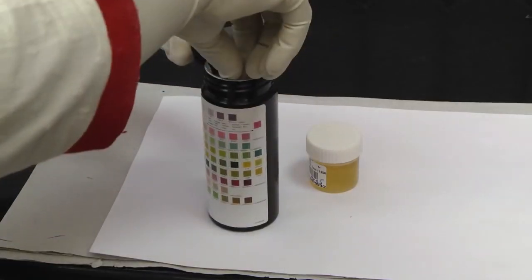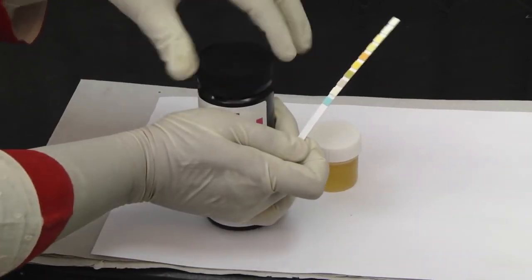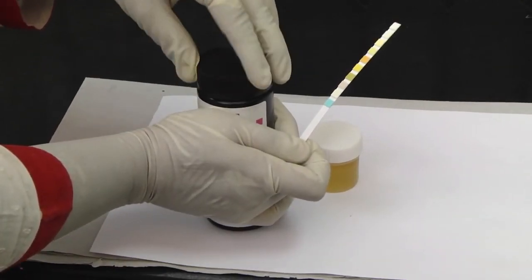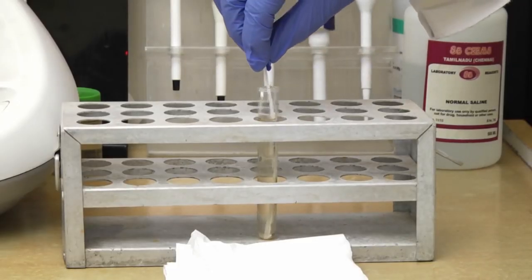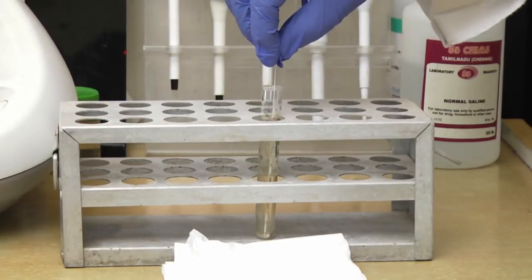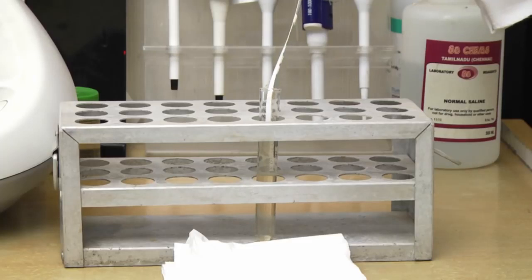Remove a strip from the bottle immediately before testing. Replace the cap tightly after removing the reagent strips. Without touching any test area of the strip, dip the strip in the sample and remove immediately. Prolonged contact may result in dissolution of the reagents.